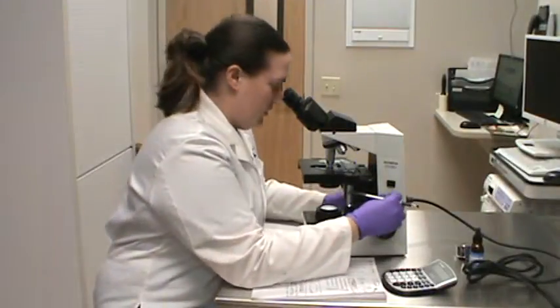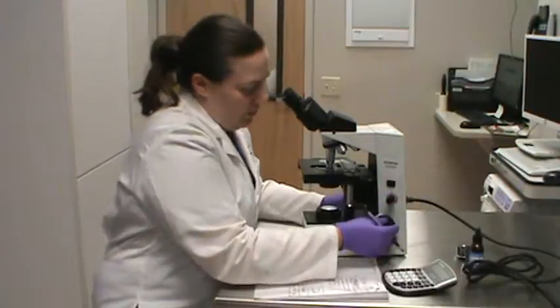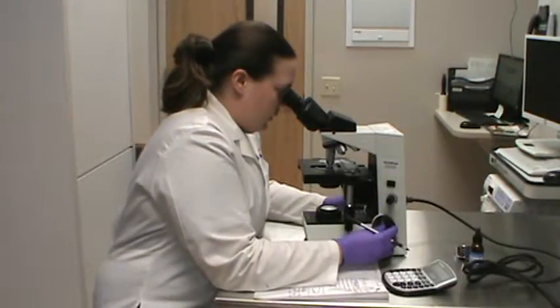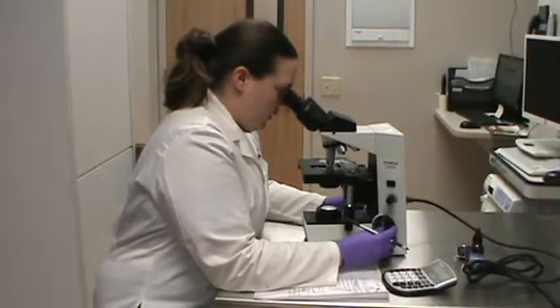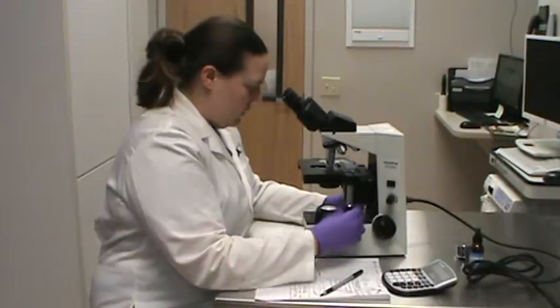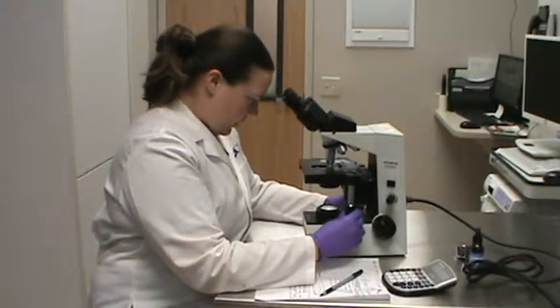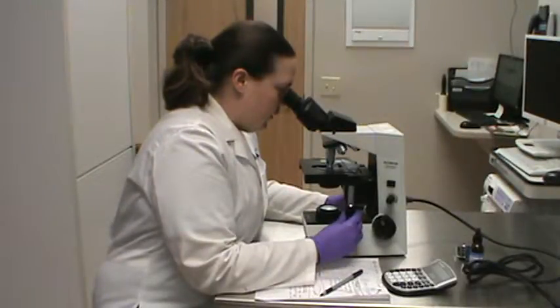Okay, just going to dim the light a smidge, focus a little bit. There we go, that's better. I'm going to start at the bottom over here in the monolayer and start counting platelets per power field.